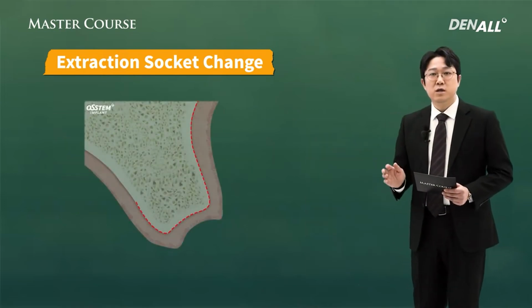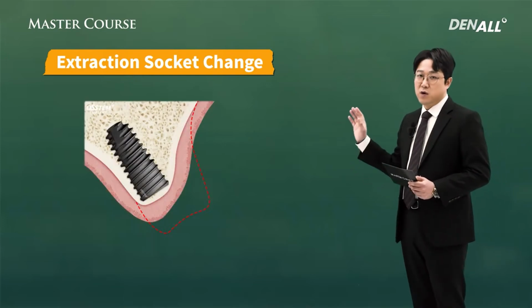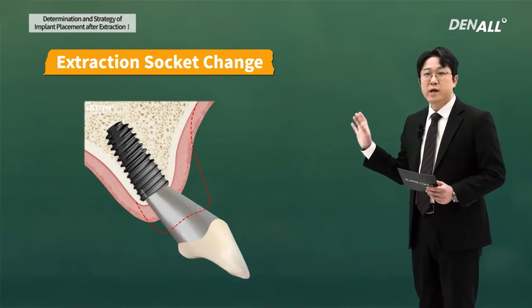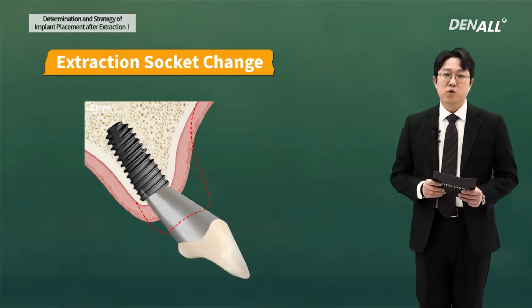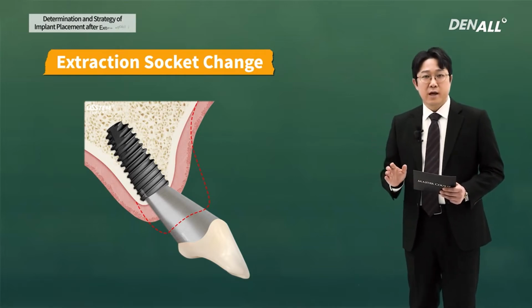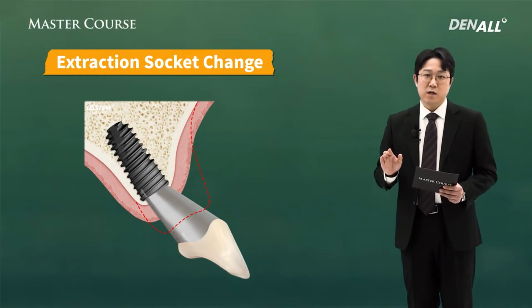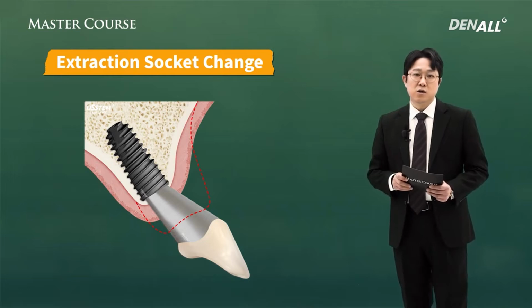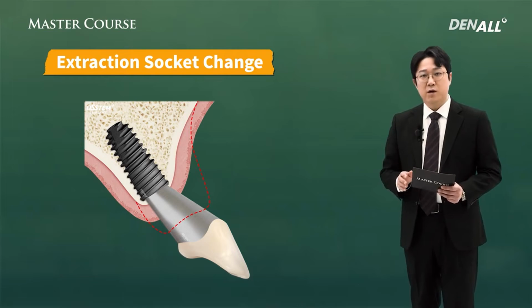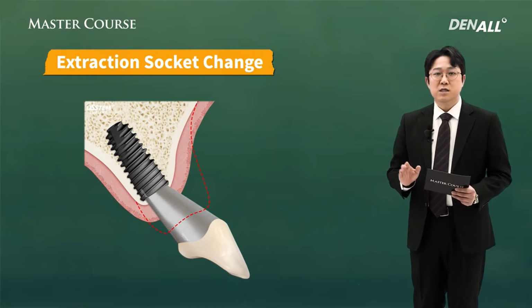The alveolar bone loss after extraction leads to an unfavorable position of the implant, and aesthetically as well as biomechanically, the prosthesis is positioned unfavorably. Due to these reasons, if you just wait after extraction is done, then the treatment period will become elongated and the alveolar bone can be very severely resorbed. In order to solve these issues, immediate implantation was proposed.